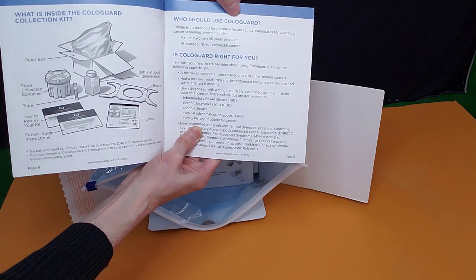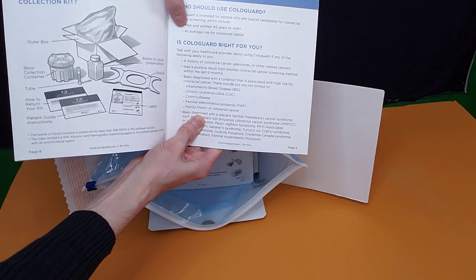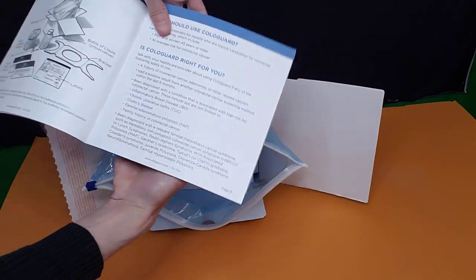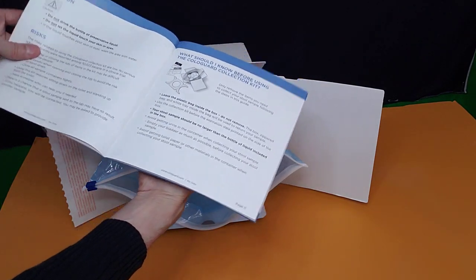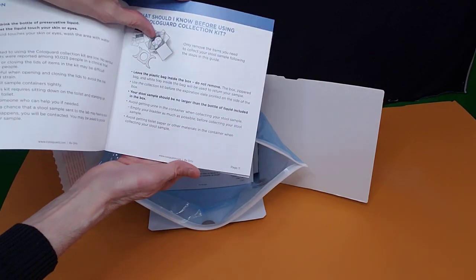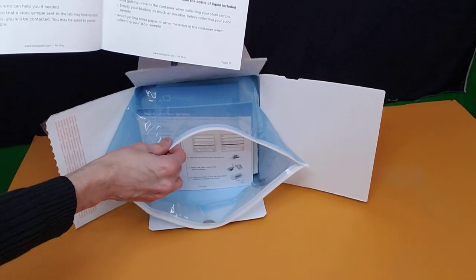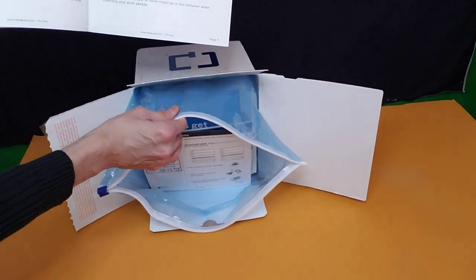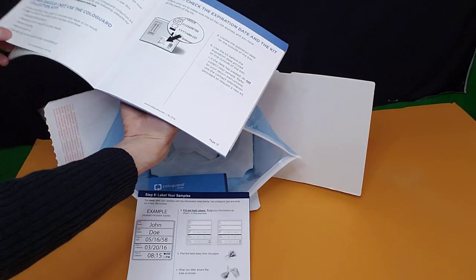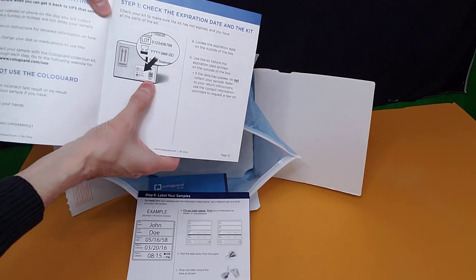Is ColoGuard right for you? What should you know before using the ColoGuard collection kit? You definitely want to leave this plastic bag inside the box — do not remove it. It's kind of glued in there. It goes on to talk about checking the expiration date on the kit, which I showed you in the beginning of this video.